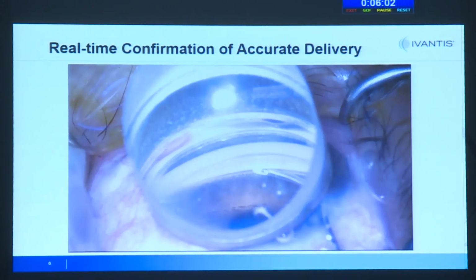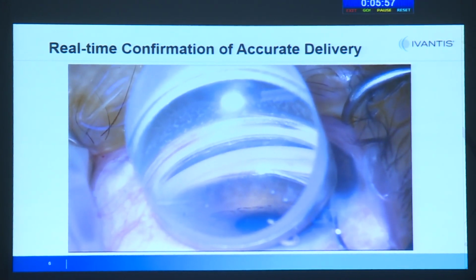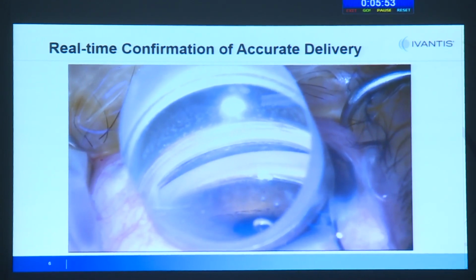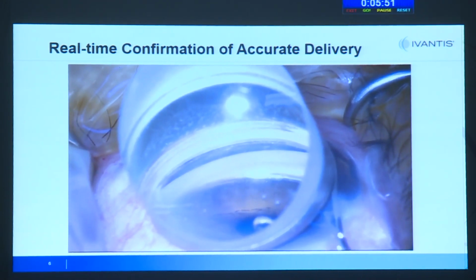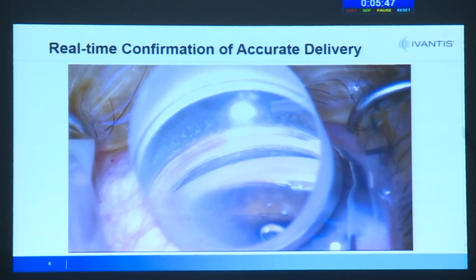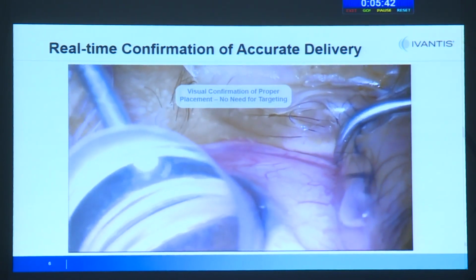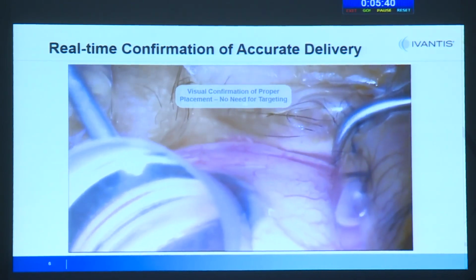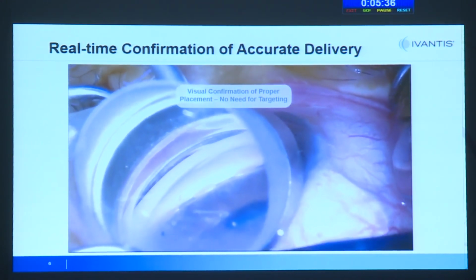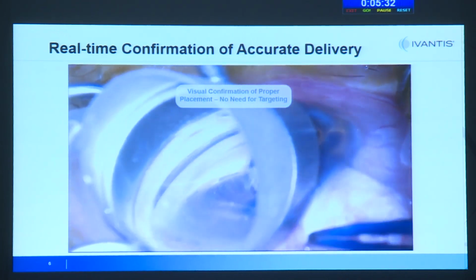Not sure if this is going to work, but video here, great. So we can see here the stent going into Schlemm's canal. You can see the 3 windows within Schlemm's canal of the stent. And because it is a rather large device, 8 mm in length, we can have confidence that it is accessing the collector channels, whereas with some of the smaller devices like iStent, sometimes we're not quite sure if we've accessed the collector channels. So here you can see on gonioscopy the 3 windows of the Hydrus device.